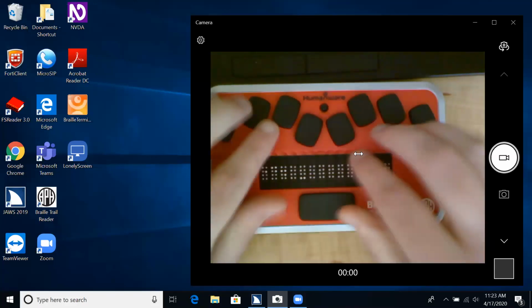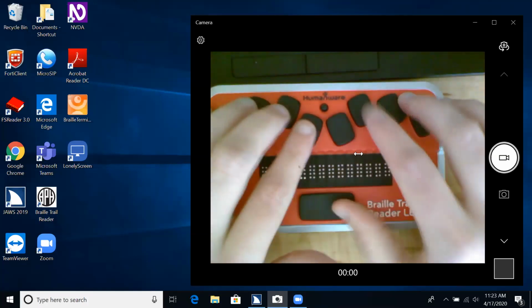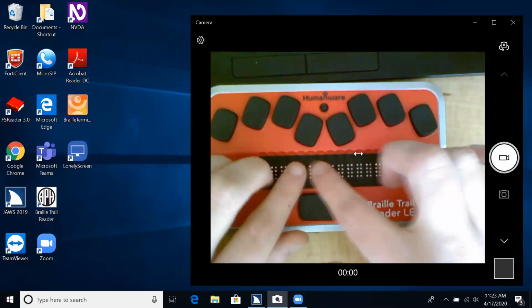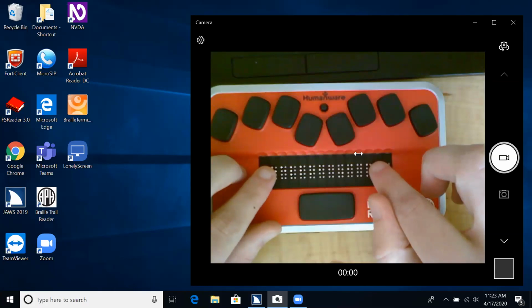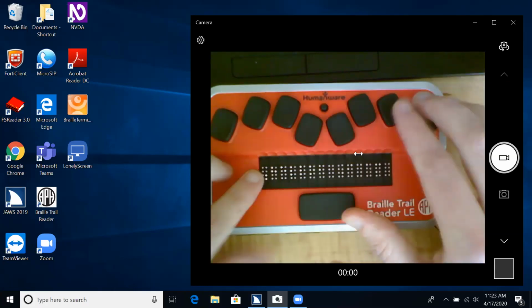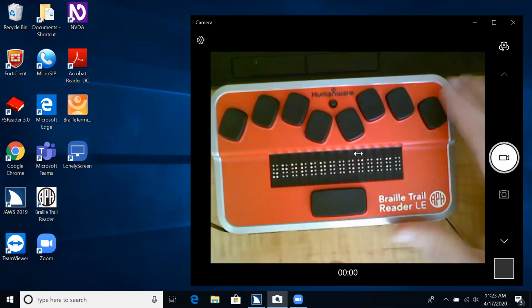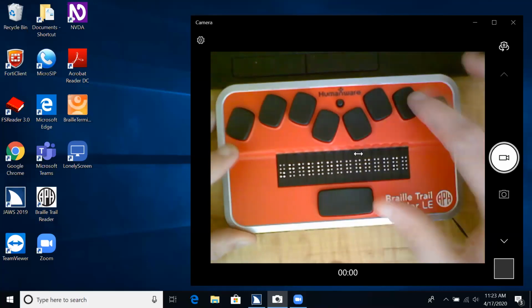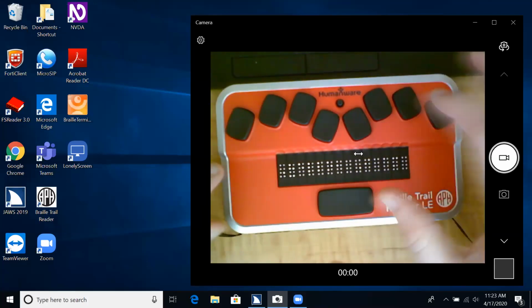With this device, we can illustrate that cursor placement very nicely, because if I'm at the top of my file, we can use those commands to move the cursor either word by word or line by line or character by character. I'm highly doubting you would actually see this happen with this webcam, but if I push dot 6 with space, I will move my cursor forward character by character.